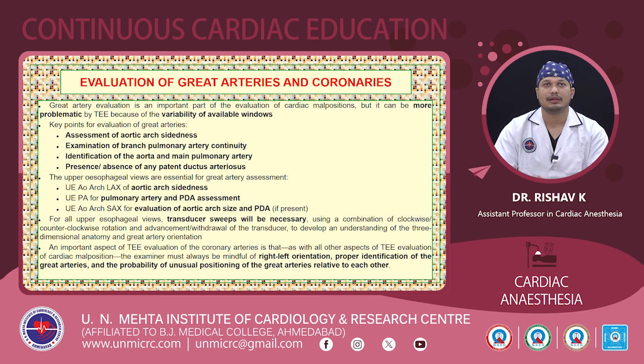Now coming finally to the evaluation of the great arteries and the coronaries. Great artery evaluation, unlike the ventricular arterial segment, is problematic because of the variability of available windows. However, we have to determine the following. Firstly, we have to assess the aortic arch sidedness. We have to determine the branch pulmonary artery continuity. We have to identify the aorta and the main pulmonary artery, and also determine the presence or absence of any patent ductus arteriosus.